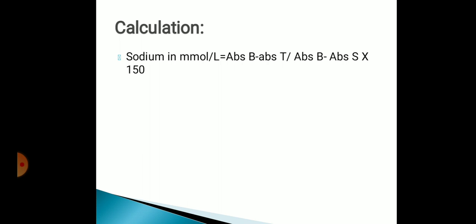Coming to the calculation, sodium concentration in the sample is equal to absorbance of blank minus absorbance of test by absorbance of blank minus absorbance of standard multiplied by 150.